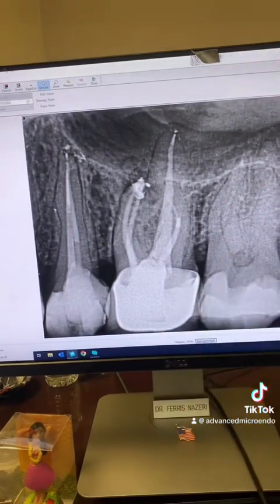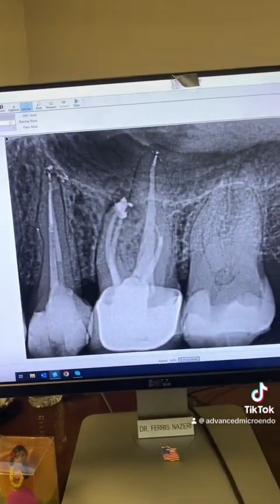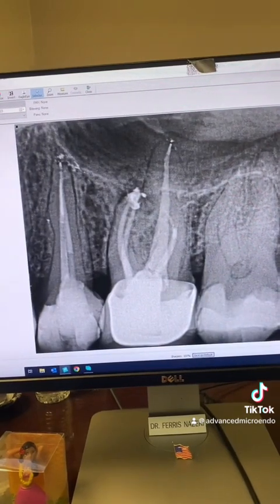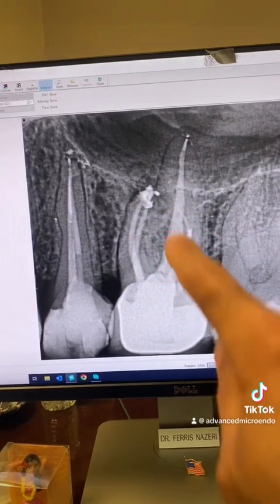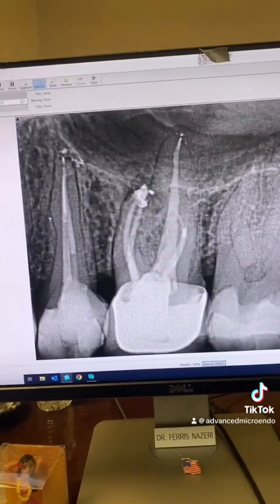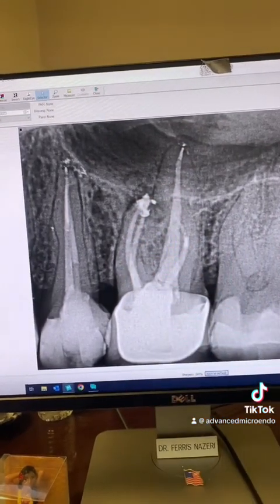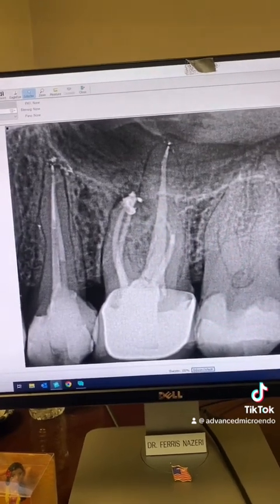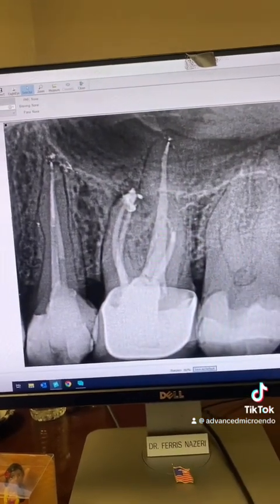And this was today, 8 months post-op of teeth number 13 and 14. And take a look here, that large periapical radiolucency associated with the mesial root of tooth number 14 is almost completely gone, healed completely. Again, that dark shadow or periapical radiolucency we call is bone destruction. And you can see after we addressed the problems associated with the tooth, the missed MB2, removed the necrotic tissue and eradicated the microorganisms, bacteria, her body started to regrow and regenerate bone there.